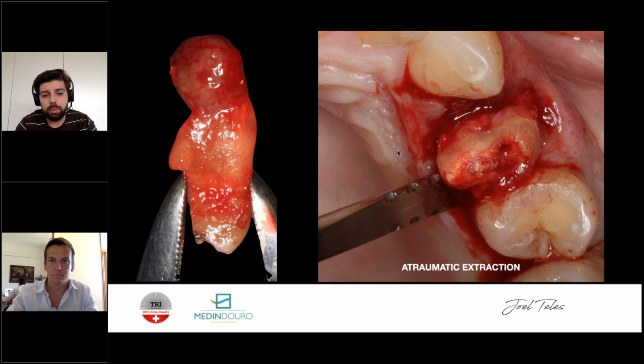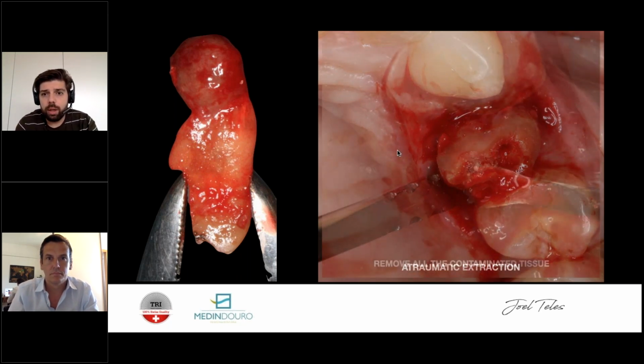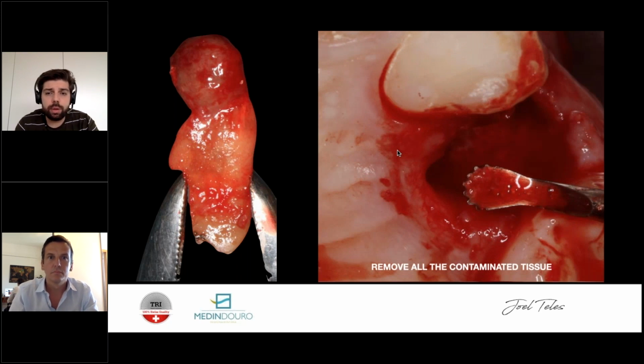For that, again, what I use is these curettes, these Lucas curettes from Schwert again. And I'm not trying to make any kind of advertisement for Schwert. They don't pay me whatsoever. It's just the things I use, and I think it's valid for you to understand what I use. This dented part of the curette, you can see that it has some indentations on it. It really helps you to remove everything. You get a really good sense of grip. There's no turning back after you try this, I assure you. Every single person I speak to who uses this says that once you go back to your old curettes, they don't work all that well.